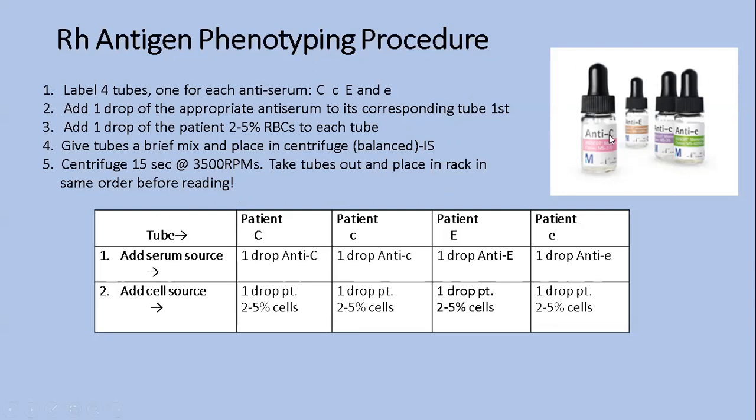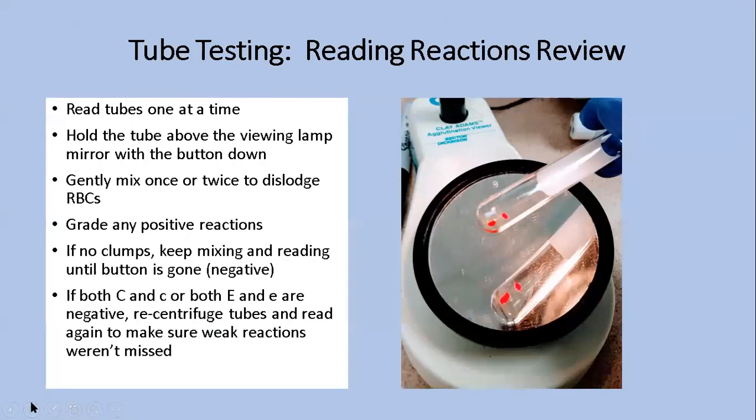So this is a picture of what the antisera look like, and so you can see, they're just bottles and they have the labels on them. So it's important that you read the labels for the different antisera. Make sure you put the appropriate one in its corresponding tube.